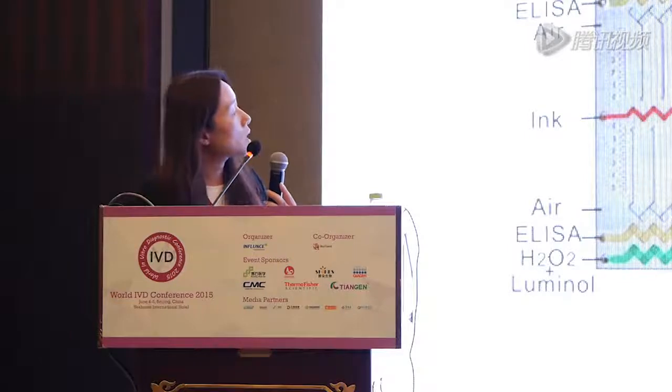So as an example here, you can see the bar chart chip. We did some improvement of the bar chart chip because we know that drugs of abuse detection is mostly qualitative testing. So we revised the chip so that it gives a more visual qualitative result. If you load the patient sample on it and the patient is positive for a drug, for example, amphetamine, then you can see the bar chart goes upward. The upward bar chart means the patient is positive, and the downward chart means the patient is negative. That's more intuitive to many healthcare providers, such as nurses. And here are some real examples of how the data look on the IVD chip.